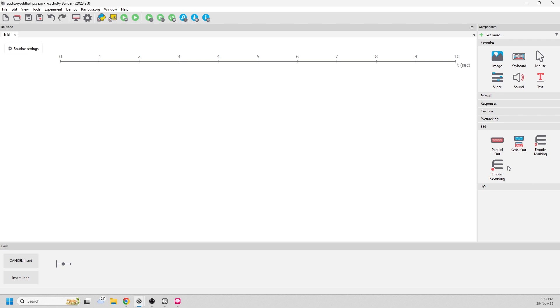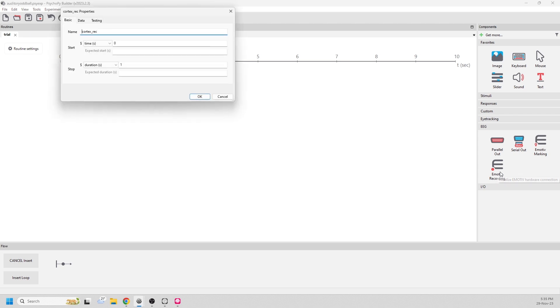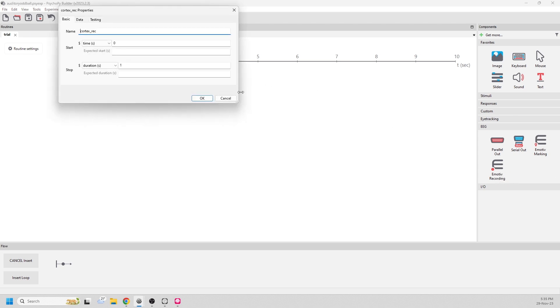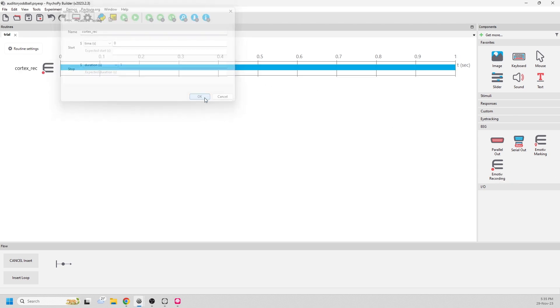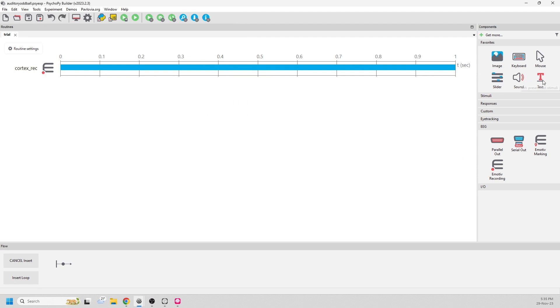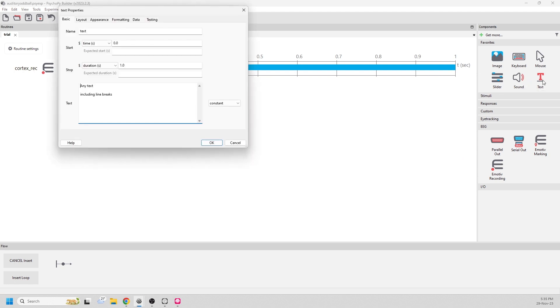Now we're ready to build the experiment. First, let's add the Emotive recording component, accepting the defaults. Next, let's add an instruction.